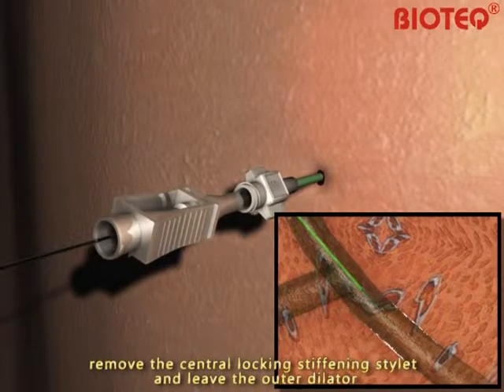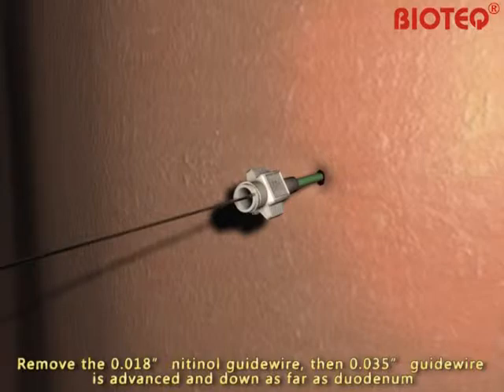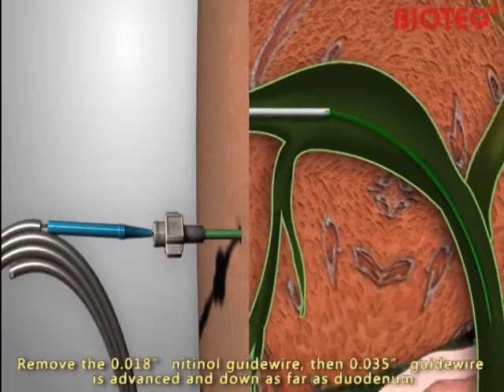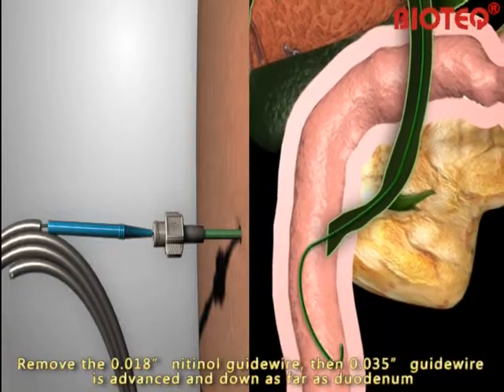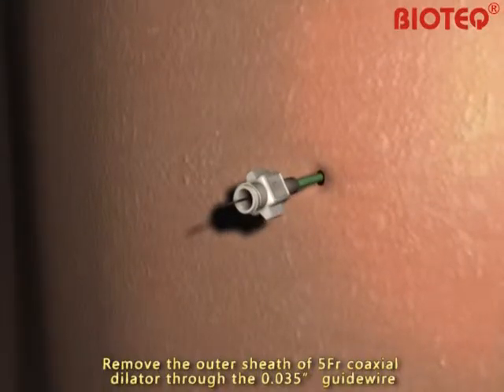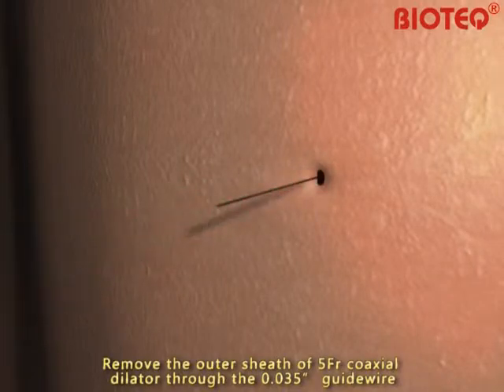Remove the central locking stiffening stylet and leave the outer dilator. Remove the 0.018-inch nitinol guide wire, then the 0.035-inch guide wire is advanced down as far as the duodenum. Remove the outer sheath of the 5-French-gauge coaxial dilator over the 0.035-inch guide wire.